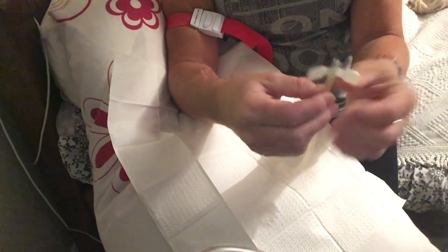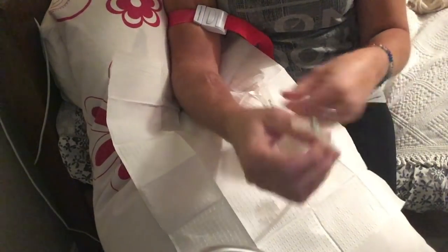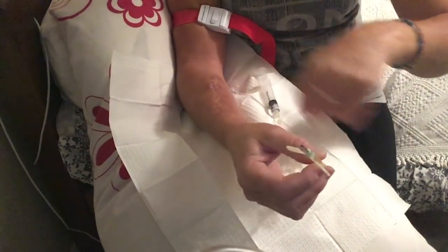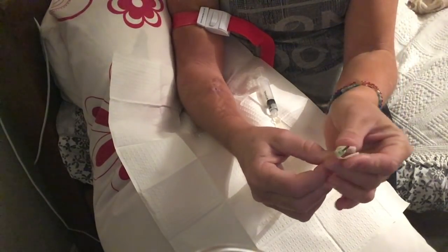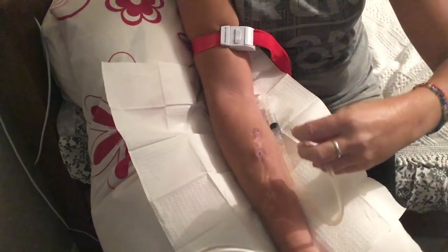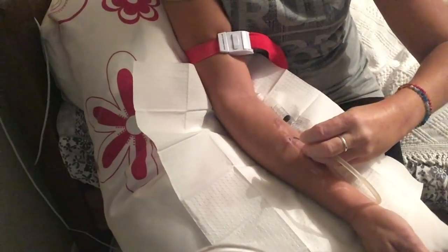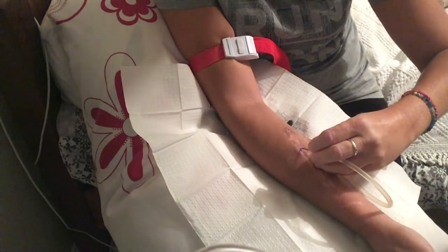These are extra-long needles, which help for people who needle themselves, because you can reach the end of it with your hand once it's in your arm. I've got my fistula laid down here just to keep my arm as still as possible, and I've tightened up the tourniquet already. So I'm just going to pop that needle in.